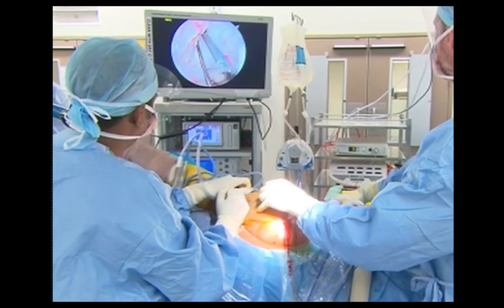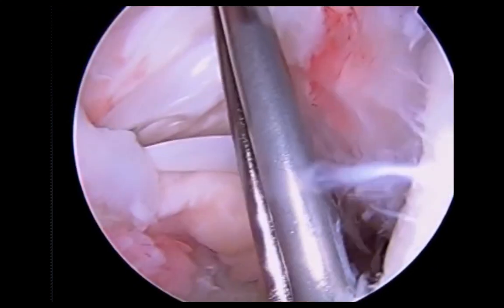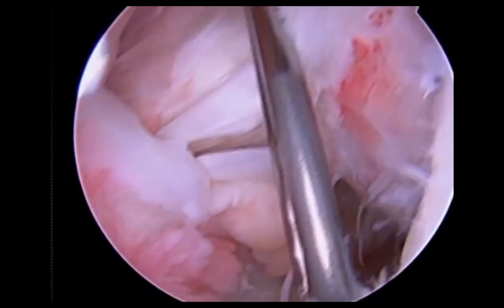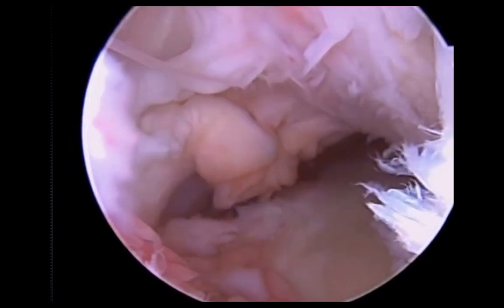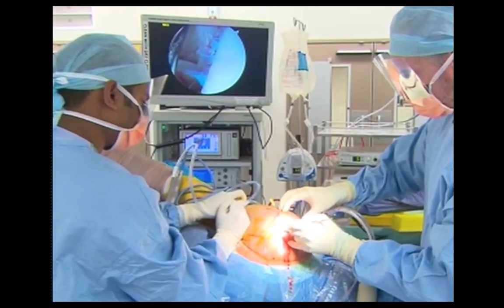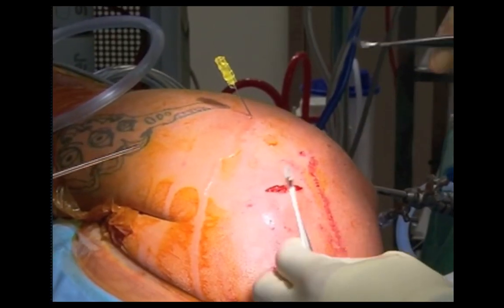By using a calibrated needle, such as this cut-down epidural needle, we can get a rough idea of the medial to lateral dimensions of the Hill-Sachs lesion. The needle is then placed through the posterior portal to assess that we're 90 degrees to the Hill-Sachs lesion. The arm can be rotated to maximise this view.